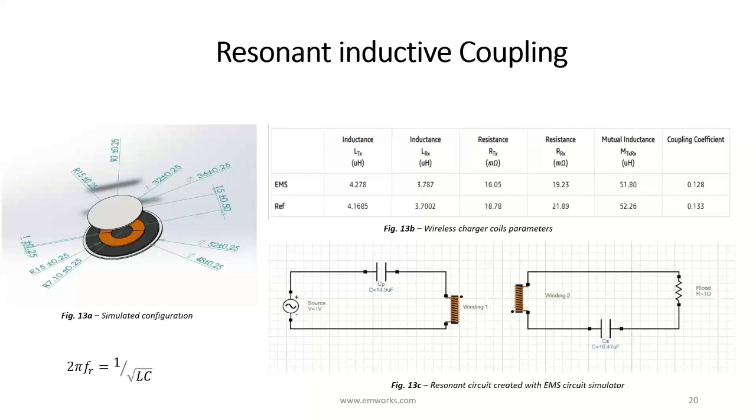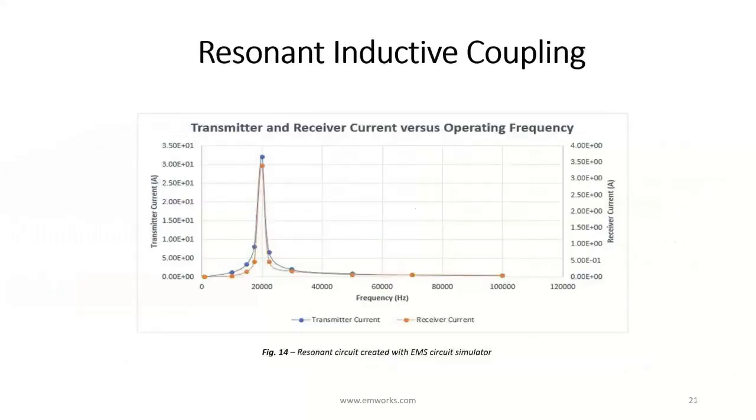We can see from figure 13b a good agreement between EMS results and our reference results. These parameters are computed at a frequency of 20 kHz, which will be used as a resonant frequency. EMS coupled to circuit is used to create the simulated resonant circuit and run the simulation. It's clear from figure 14 that the resonance has a great impact on the wireless output data. We can see that at the resonant frequency, which is 20 kHz, both the induced voltage and the current of the receiver are too high compared to the rest of the frequencies.